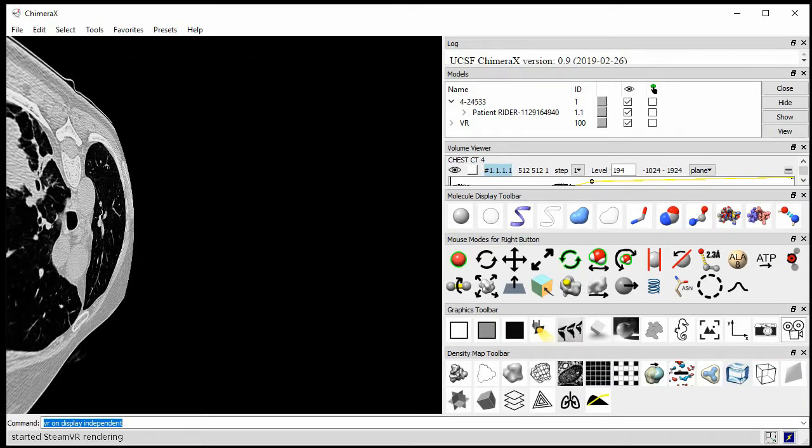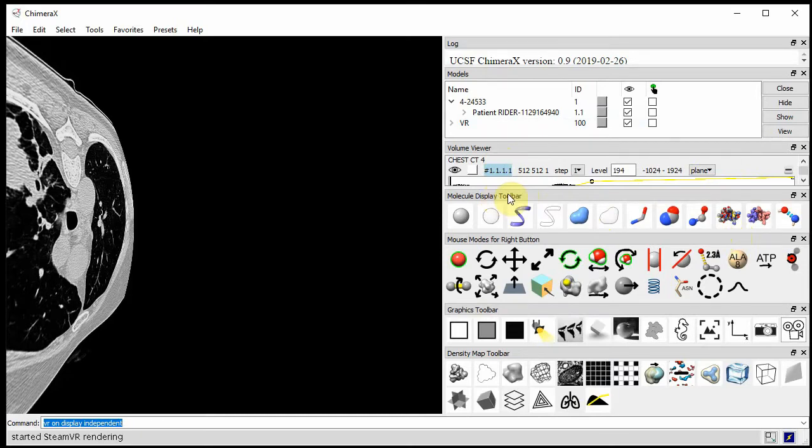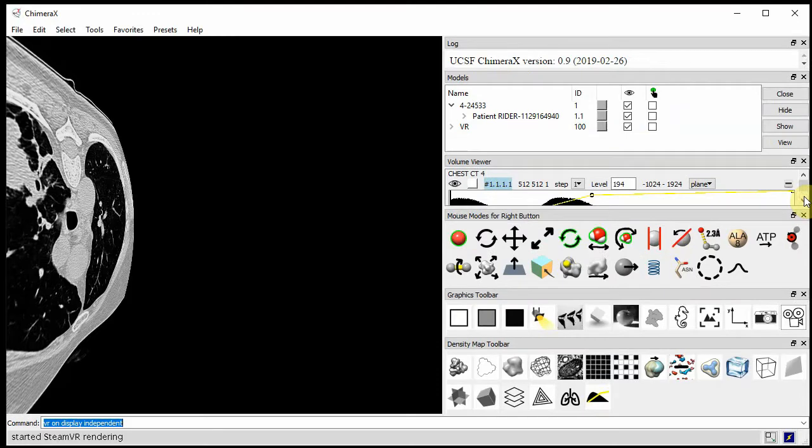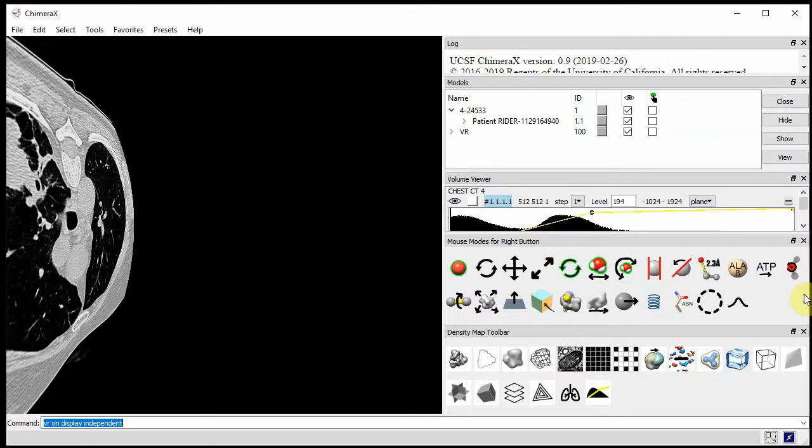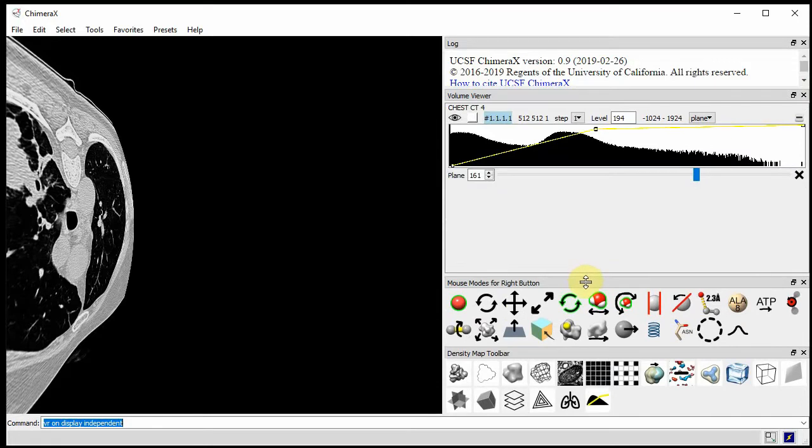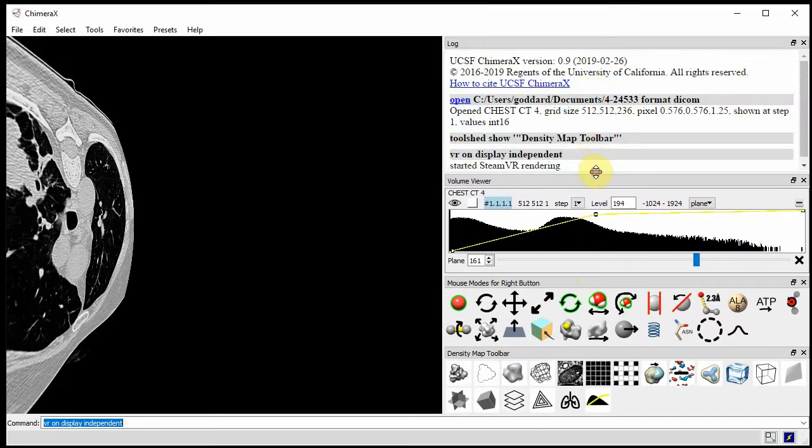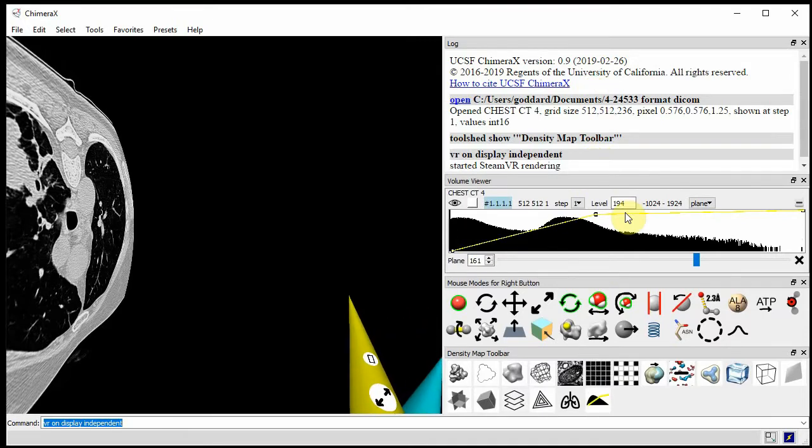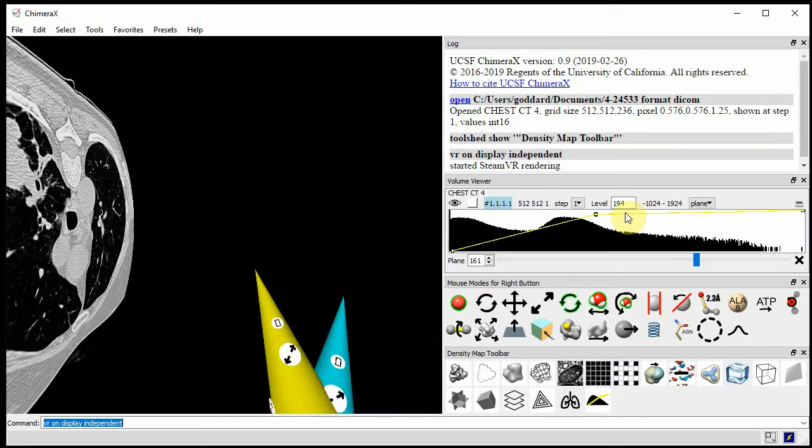We're not going to need some of these panels in the demo, so just so we don't have a cluttered display in the VR, I'm going to hide this molecular display toolbar, this graphics toolbar. I don't think we'll use this model panel. It shows the current data we're looking at. Let me squish some of these things down and move this down. I'm putting on the VR headset now and it's a Vive Pro headset we're going to be using.